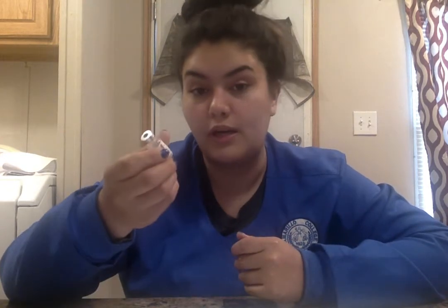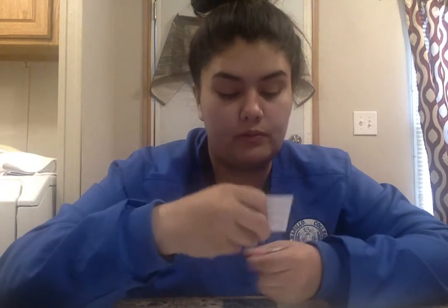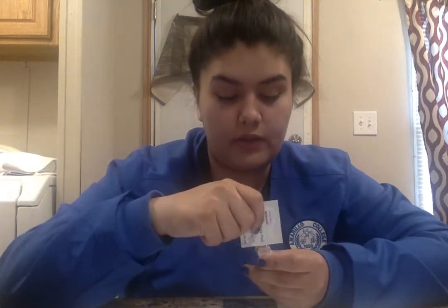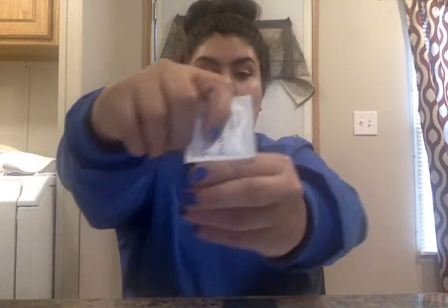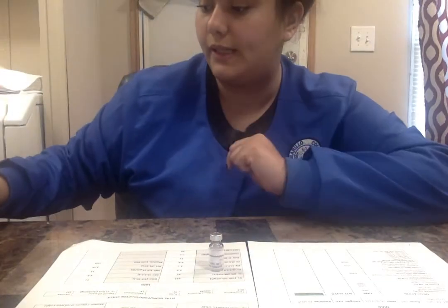So now we're going to go ahead and prepare our medication. Since this would be a glass ampule, we would grab our alcohol prep pad. We would rip it open, shove the glass in there. We would break it away from us. We would put it on the table.